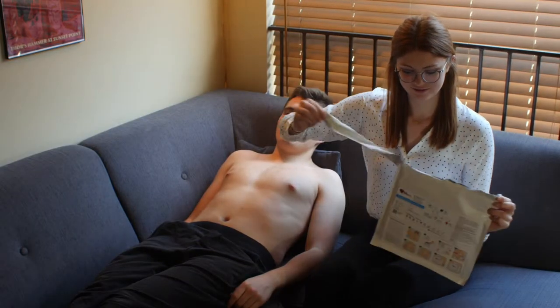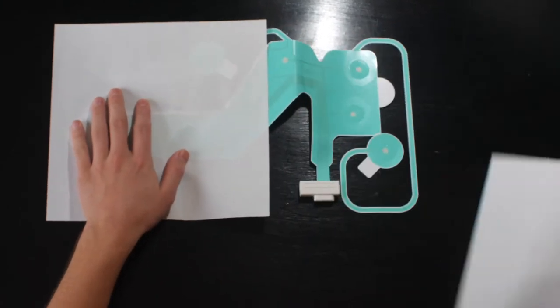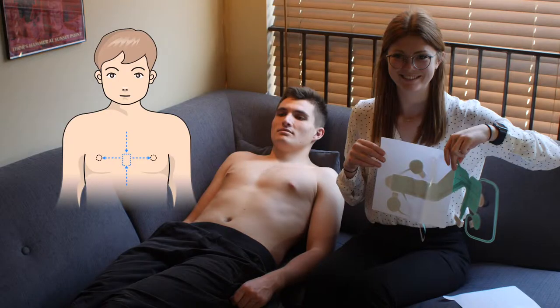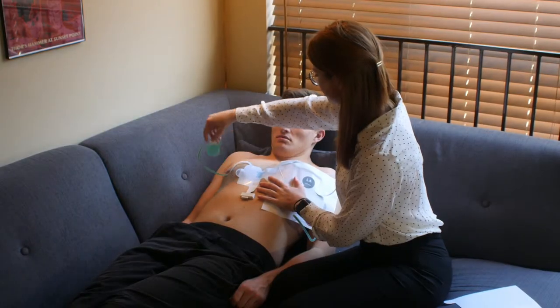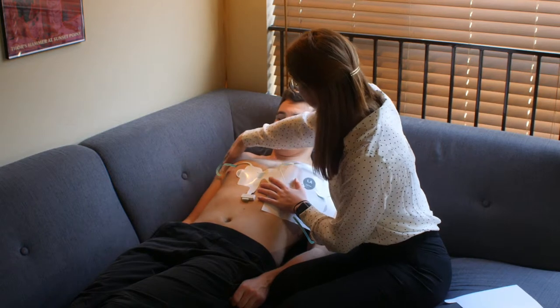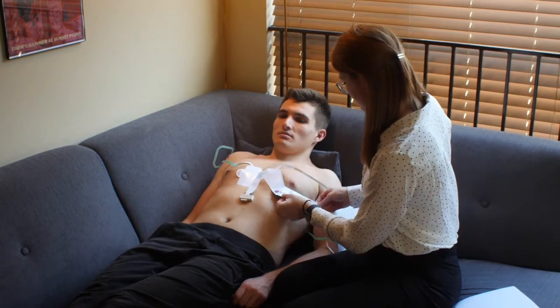Next, remove the strip from the packaging. Pull the tab on the back side of the electrode strip and peel off the first half. Place the blue square right on top of the chest bone or sternum at a level between the two nipples. Take the electrode labeled RA and place it on the patient's right shoulder. Remove the remainder of the backing. The tail of the strip will wrap around the left chest.